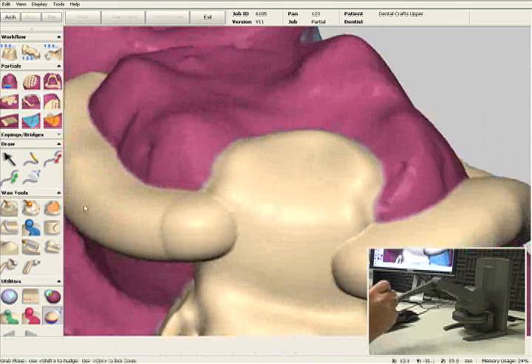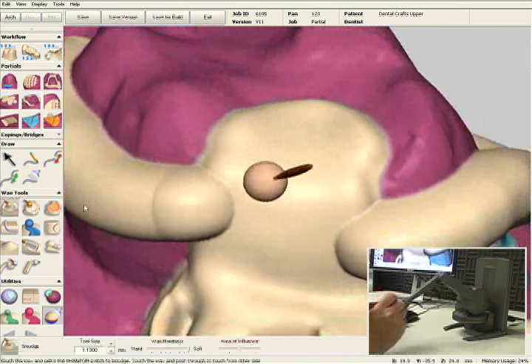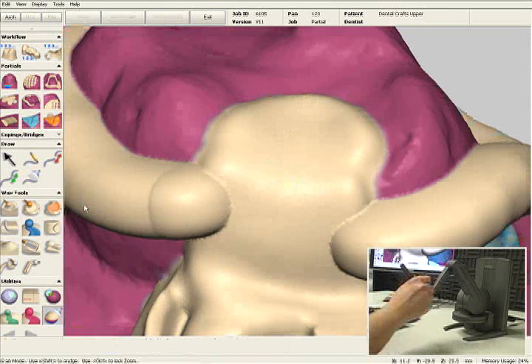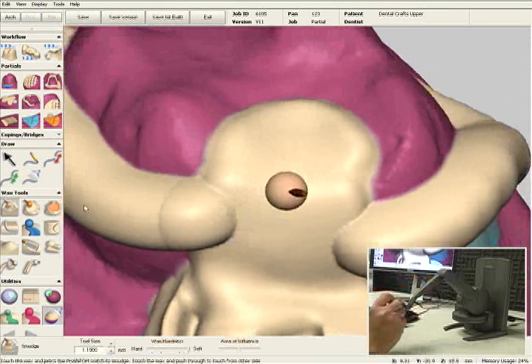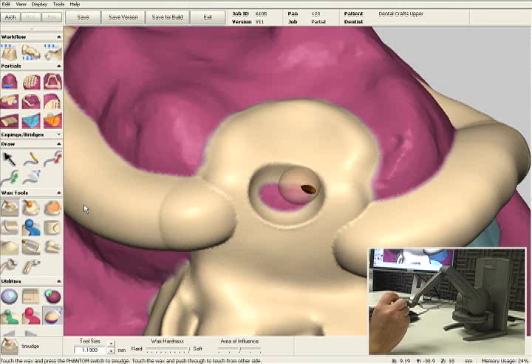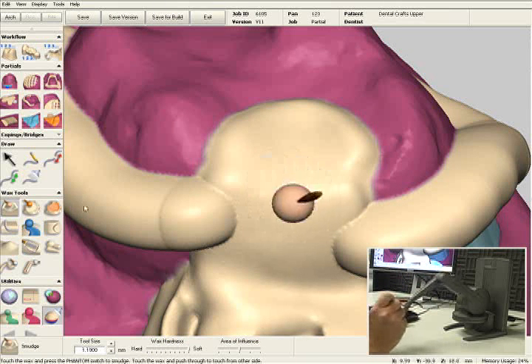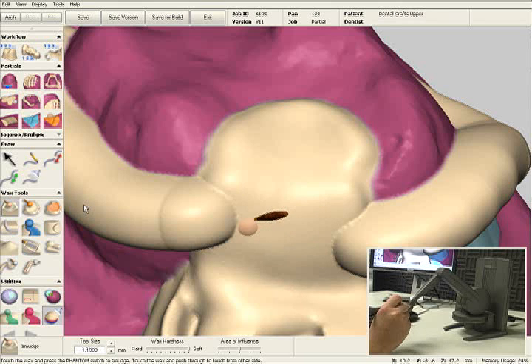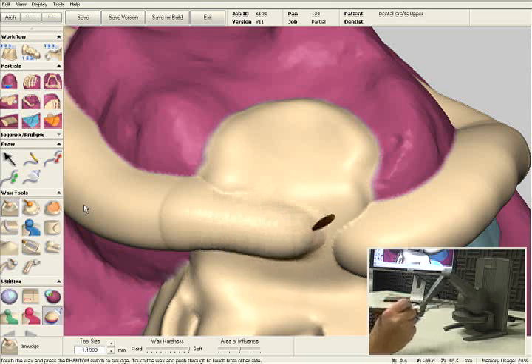This tool works in two ways. I'm going to make it a little bit larger. When I'm working on top of the model or on the outside of the wax, I can remove wax — like I'm doing right now. If I pop through to the inside of this wax, I can add wax on top.